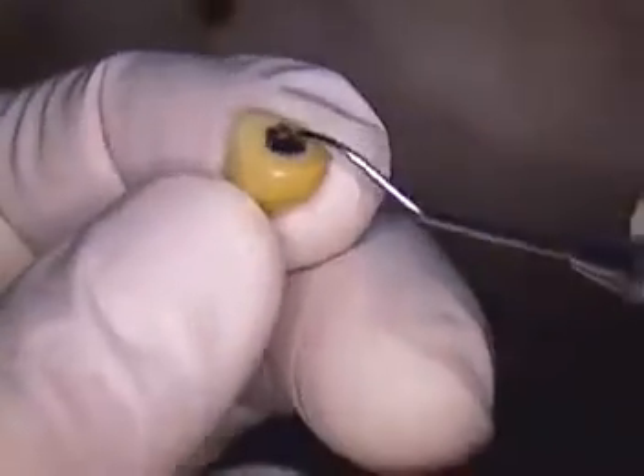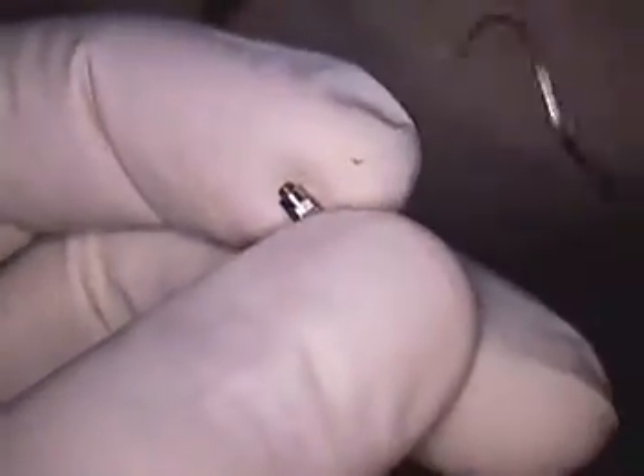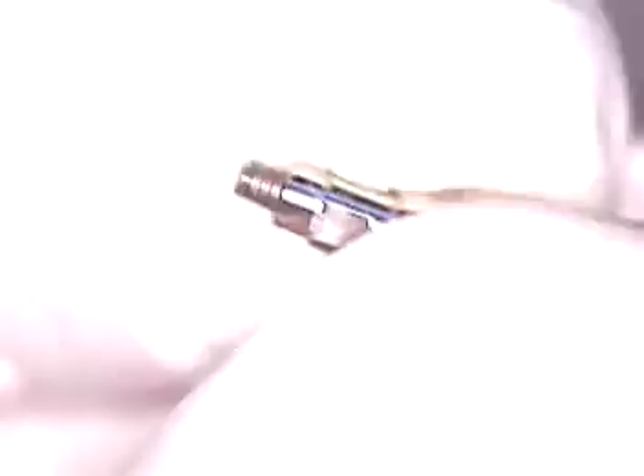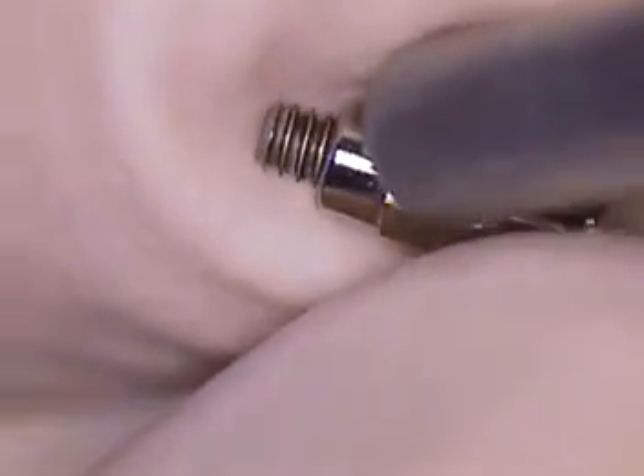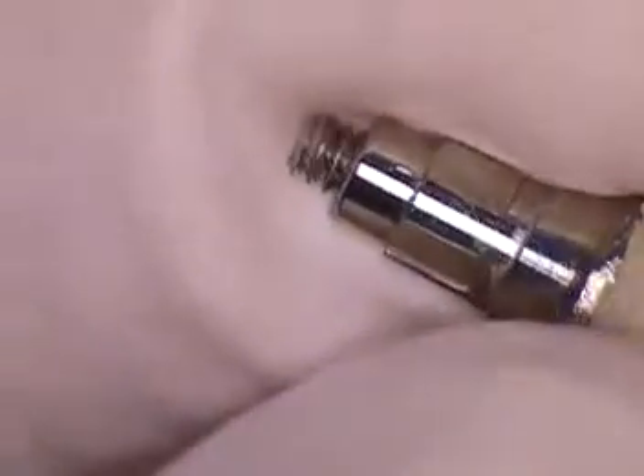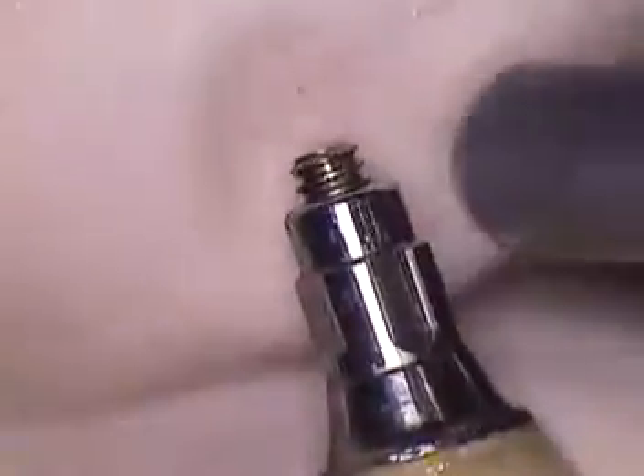So we're back here, getting ready to put this back in. The first thing I like to do is just double check the threads — make sure we're not reintroducing any microbial burden. It looks like our threads are good. We did put it in peroxide, just regular peroxide in a dish. There's some debris in there, so we'll take a brush, dip it in peroxide, and just scrub it. You'd be surprised what comes off. Air dry it again.